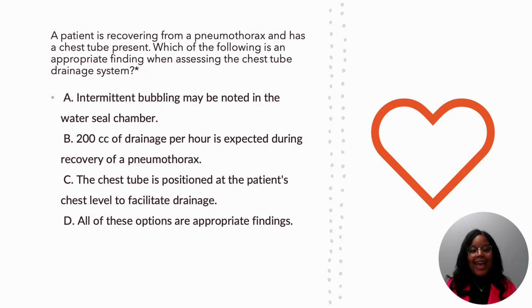So if you chose A, you are correct. So in the water seal chamber, if that patient has a pneumothorax, you will see intermittent bubbling. Why? Because it's sucking the air out of that pleural space and it's going into the drainage system. So you will see intermittent bubbling.